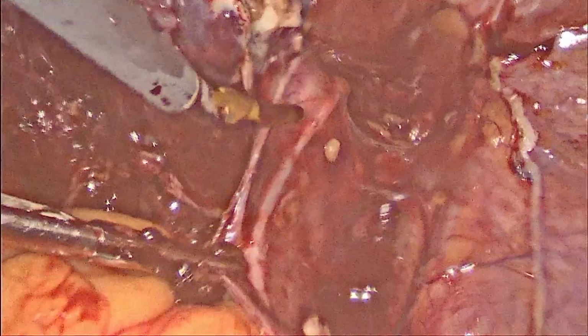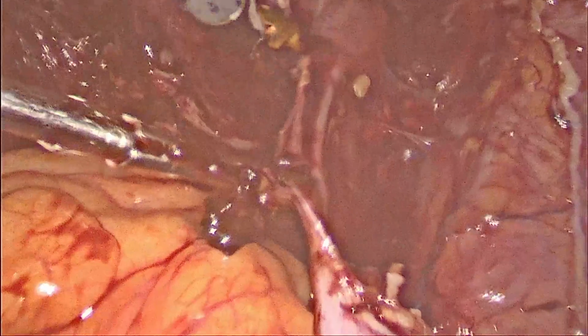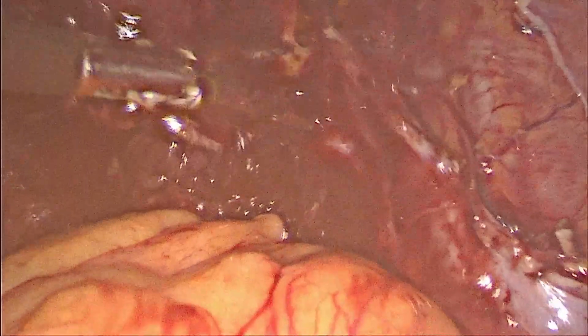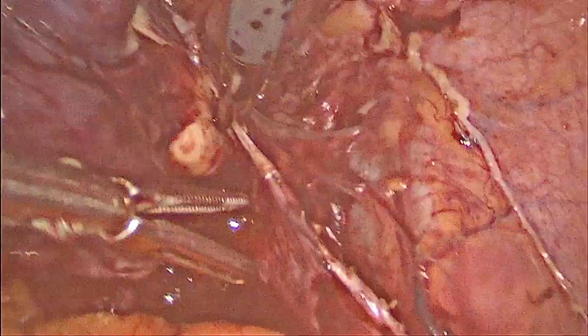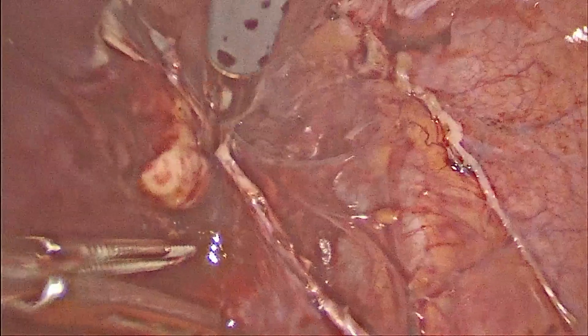Before dividing the adnexa, once again we are trying to confirm the site of the ureter, which was seen well away from the surgical field. Nearly 2 cm of space is available. Now we are trying to remove the adnexa, that is, the tubo-ovarian mass of the right side.